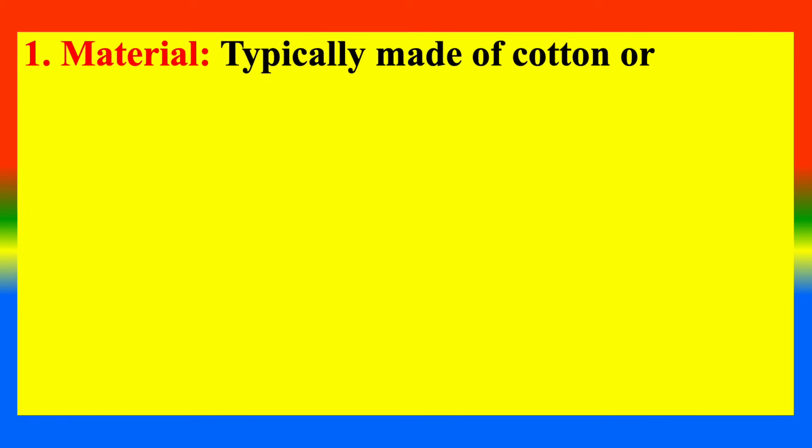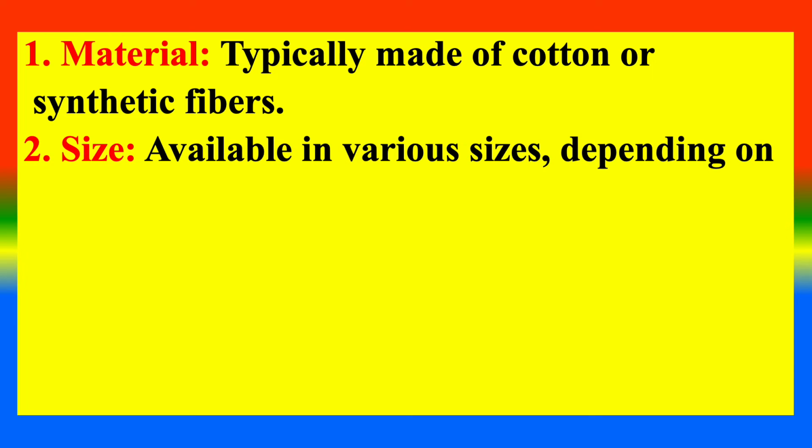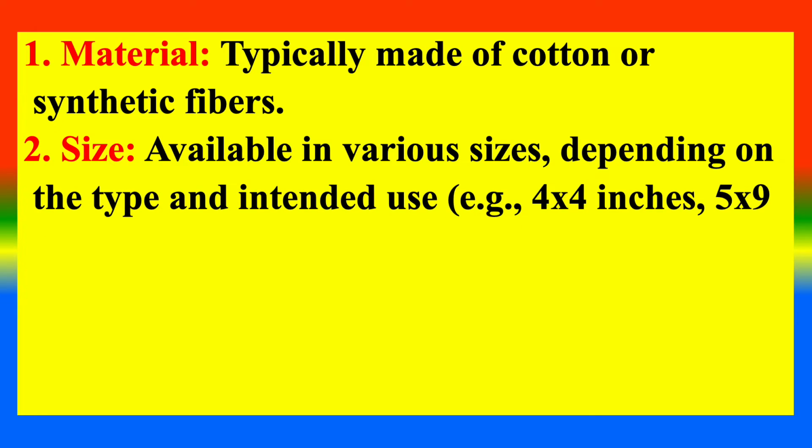Parts: 1. Material, typically made up of cotton or synthetic fibers. 2. Size, available in various sizes depending on the type and intended use. Example: 4 by 4 inches, 5 by 9 inches.